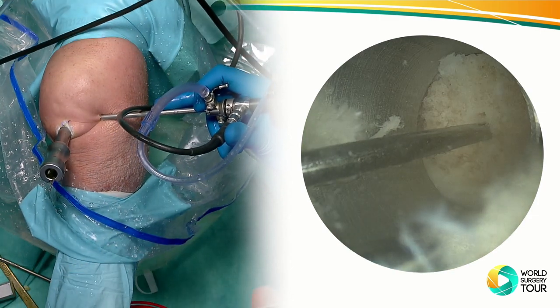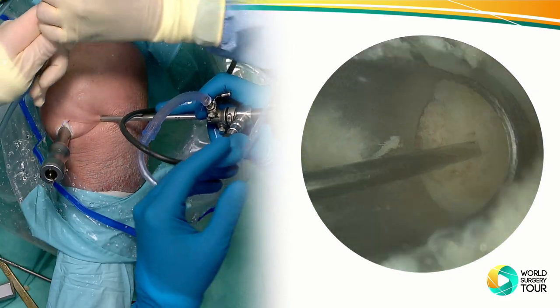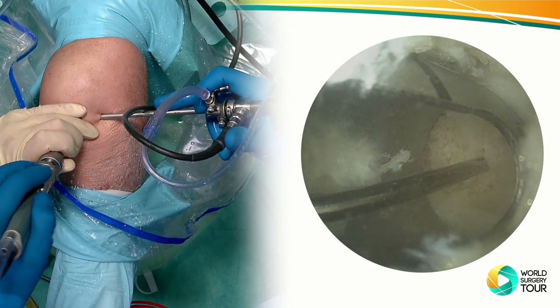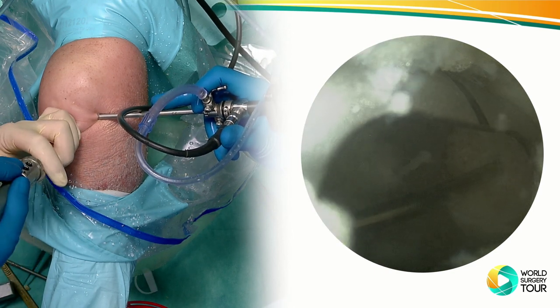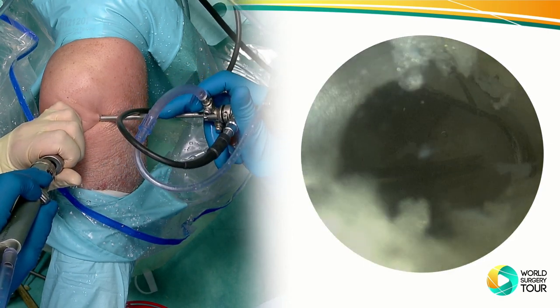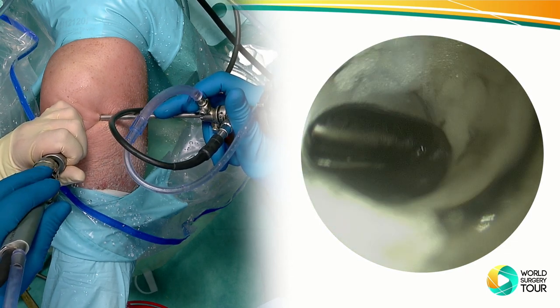Can we try suction on there? Okay, here we go. Careful, the cannula doesn't move. Got it. Take care of the K-wire, the central one. There. Do you want to take it out? Let's see. Okay. Hopefully now. Yeah, here we go. Slowly.